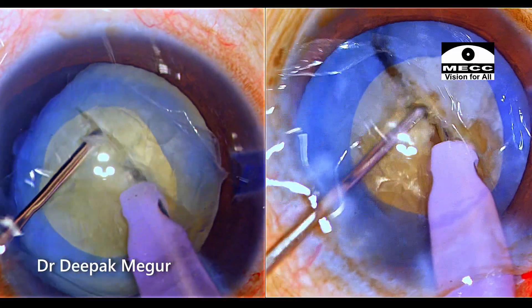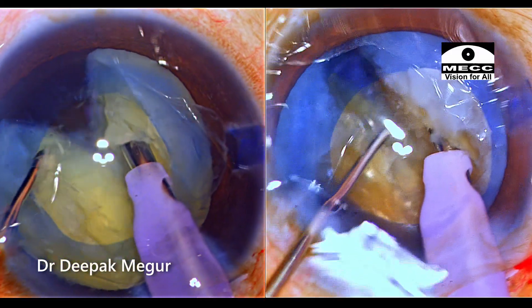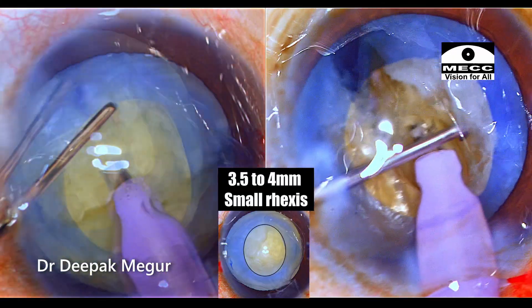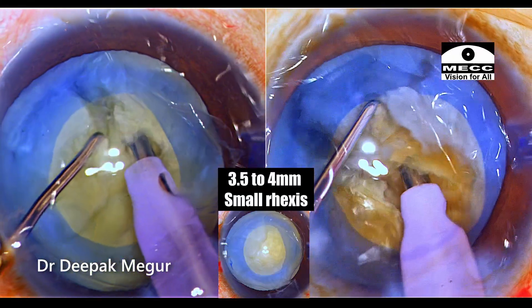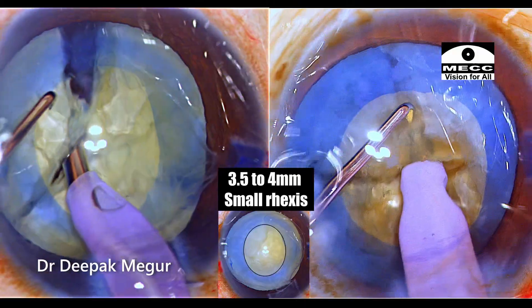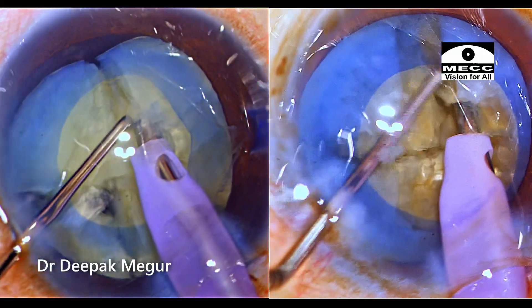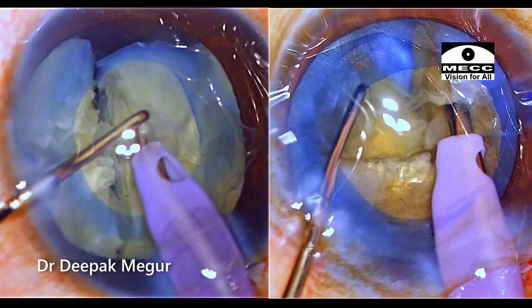If we are forced to perform phacoemulsification in a rhexis which is smaller, what are the precautions which we need to take in these situations? Let me discuss this issue in this video. I'll be demonstrating these situations in two different cases. Let me begin by starting with the first case.